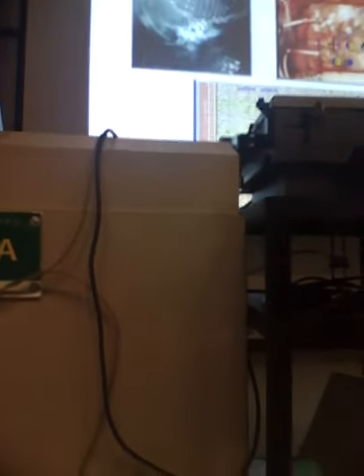Now, an extension of EEG is what's called intracranial electroencephalography. And I told you that these signals have very poor spatial resolution. Now, to improve the spatial resolution, what's sometimes done these days is to open up the skull and take a big chunk of bone off the skull, expose the brain, and put the recording electrodes directly on top of the brain. That's why it's called intracranial. Intracranial, because it's inside the cranium.